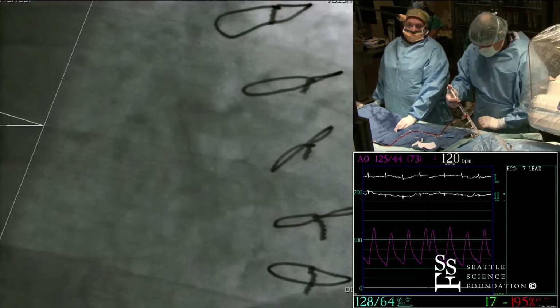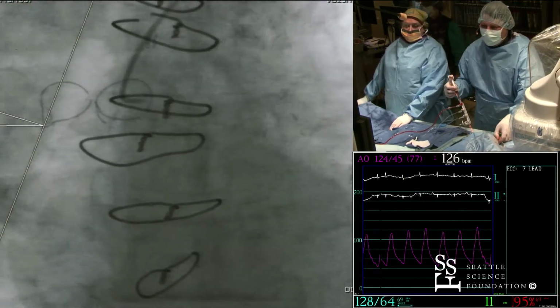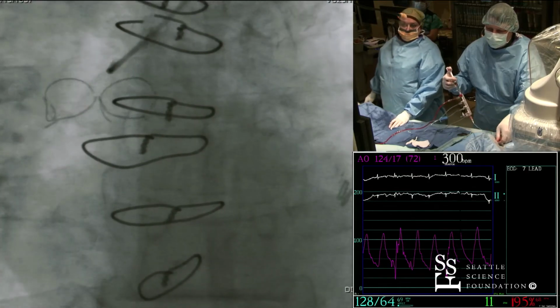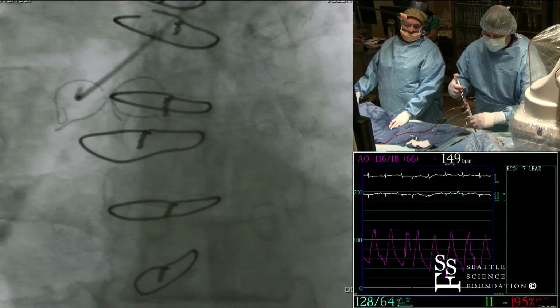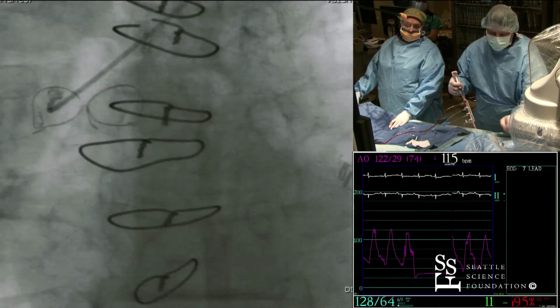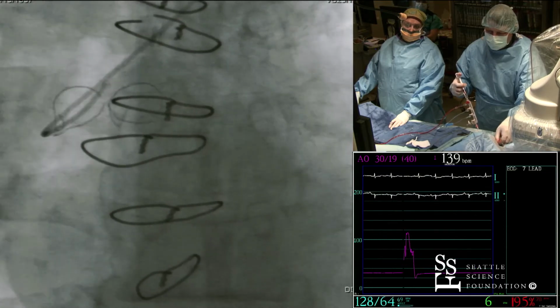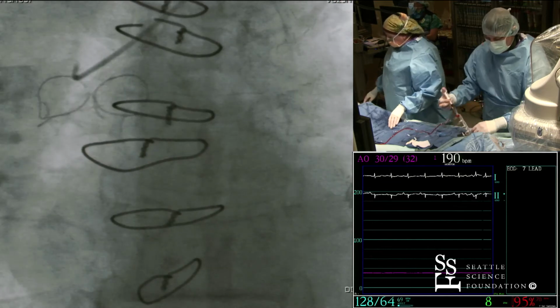Okay, so let's do the following. Let's change out for a multipurpose and see if we can get at that other graft. I don't think that this is going to get in there. So all our catheter exchanges we'll do over the Rosen wire. He's already got a Rosen wire. Okay, good. All right.